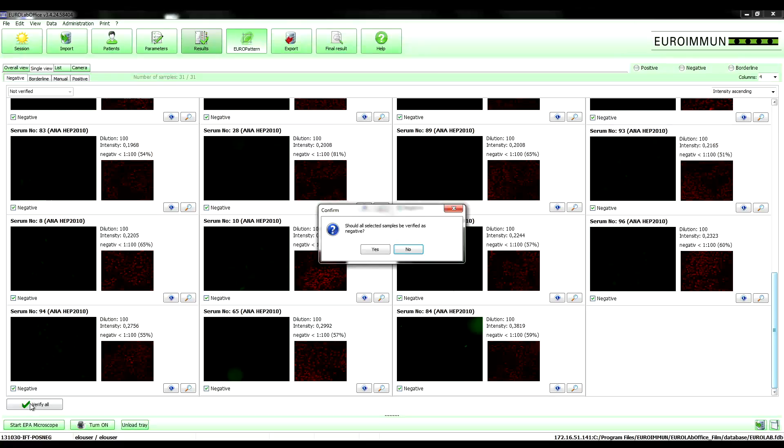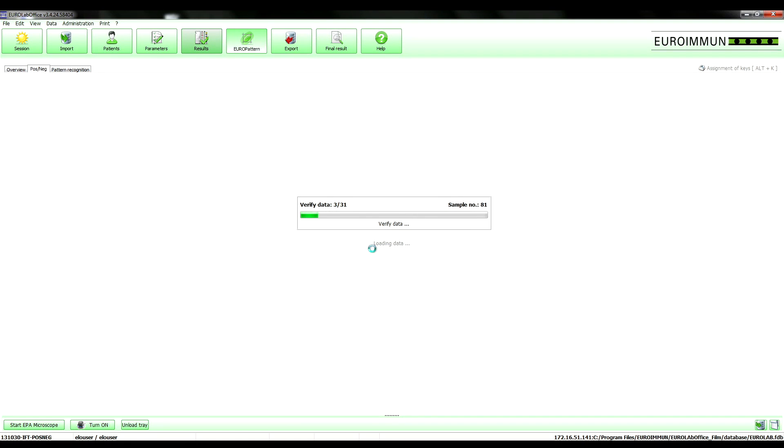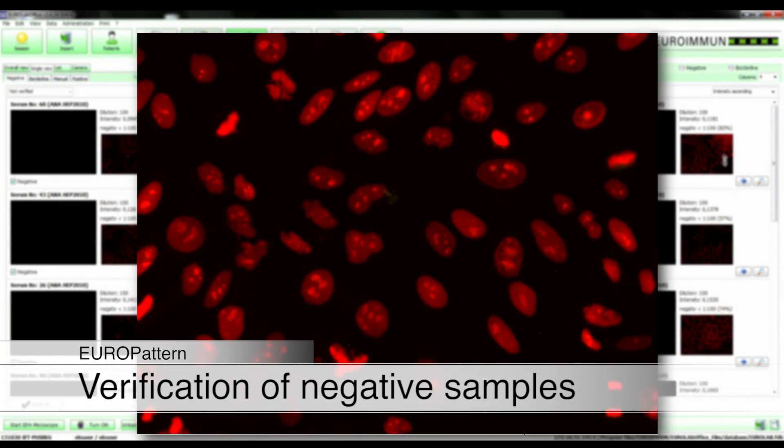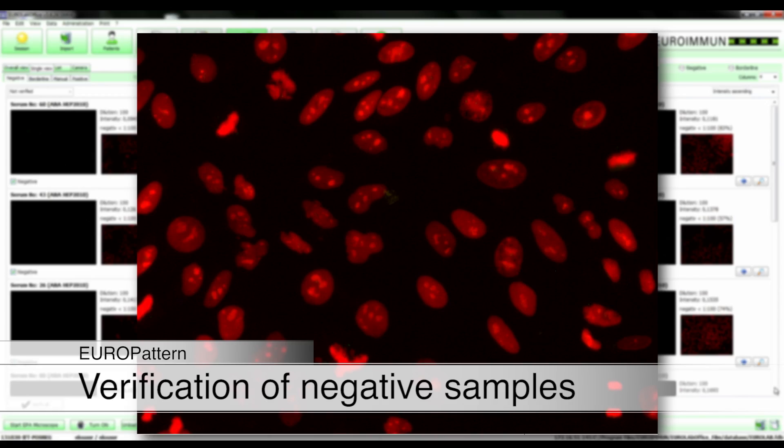The software allows for reduction of the verification effort for samples classified as negative by one mouse click. In order to avoid false negative results, the successful auto-focusing is automatically checked.